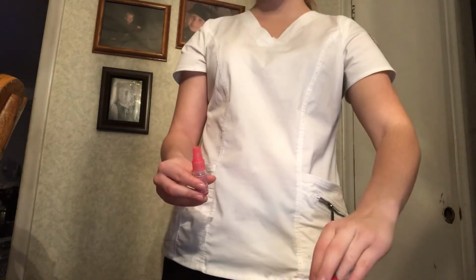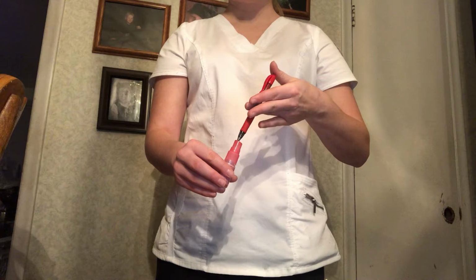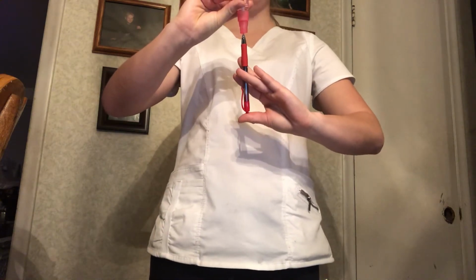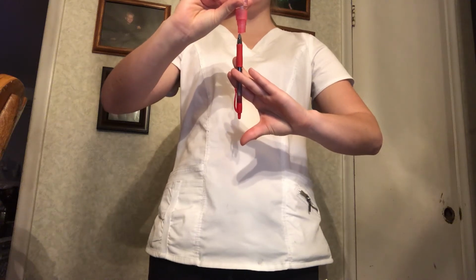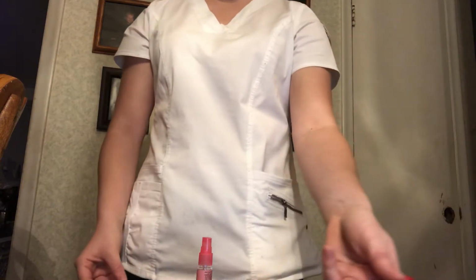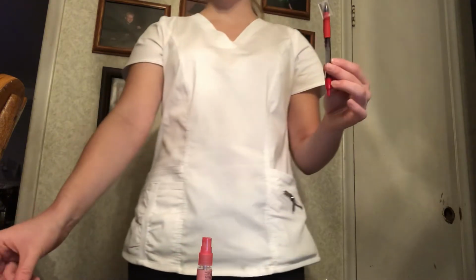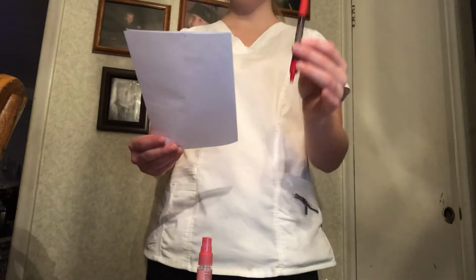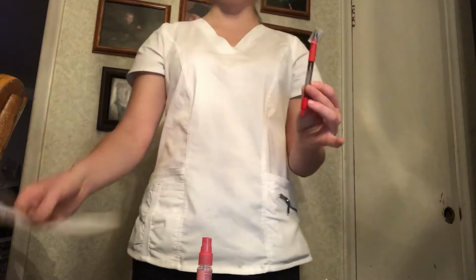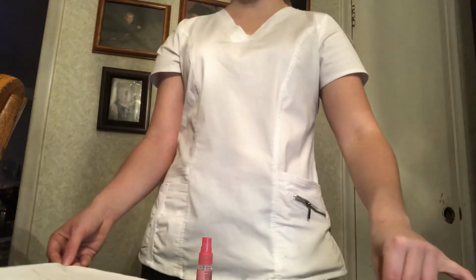I'm going to take a U100 syringe and put 30 units of air into that syringe. I'm going to put that into my vial and deposit the air into the vial. Now I'm going to flip the vial over and pull out 30 units of insulin into the syringe. Now that I've done that, I'm going to use a one-handed swooping technique to get the cap on the insulin needle. Now I'm going to check against the MAR again and make sure this medication is correct. Then I'm going to take this into the patient's room.